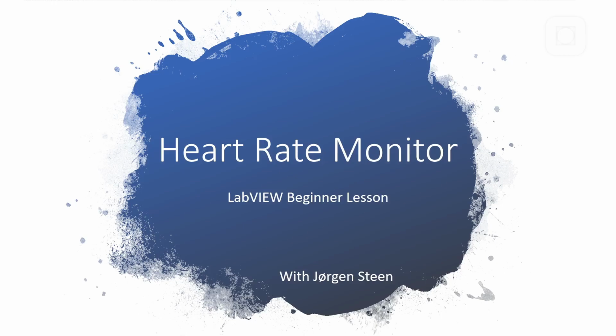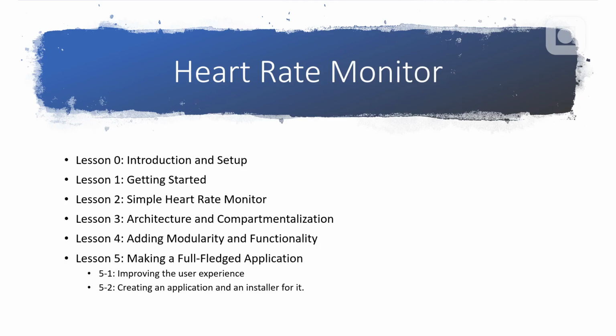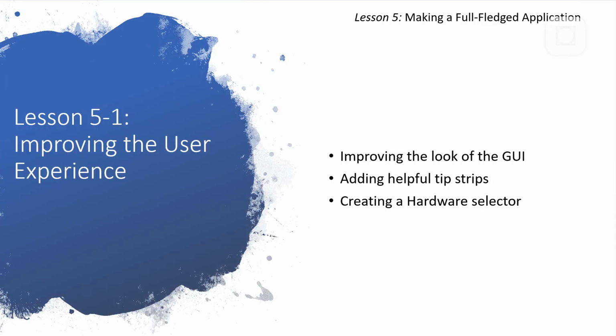This is a LabVIEW Beginner lesson where we make a heart rate monitor. This is the first of lesson 5. In lesson 5, we'll focus on finishing up the application, improving the user experience, and then creating it into an application and then an installer, which you can install on the PC without LabVIEW. Lesson 5-1, we're improving the user experience.